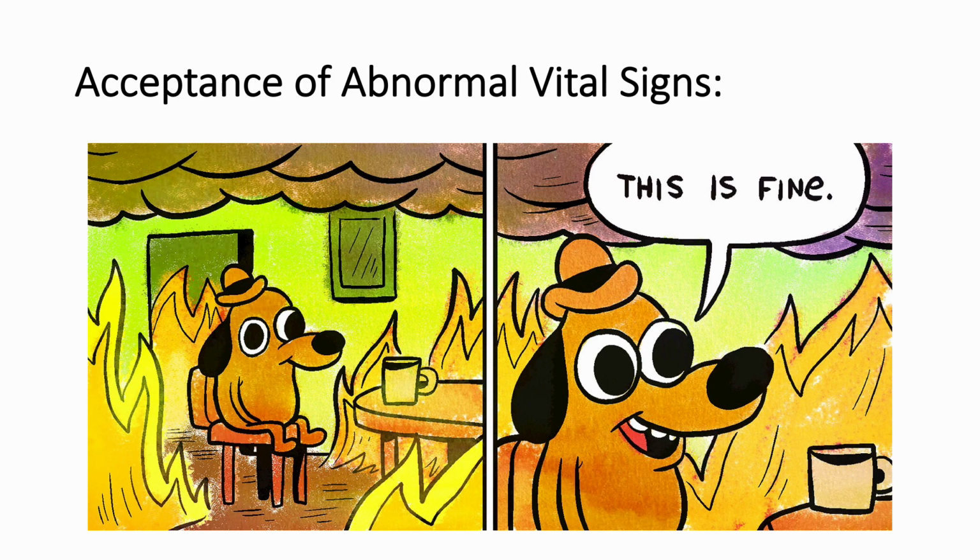Because our goal is always to do the best for our patients while doing the least harm, we should take the opportunity to discuss the third option for managing low SpO2, which is the acceptance of abnormal values without any additional intervention. And with this, we've arrived at the second main purpose for this learning module. Perhaps the answer is that we do not need to make any changes at all, and by not reaching to achieve higher SpO2 targets, we can avoid high pump speeds, which we know destroy red blood cells and may cause chatter and suck down events, triggering needless intravenous fluid boluses, while simultaneously avoiding the negative consequences of prolonged deep sedation and paralysis.